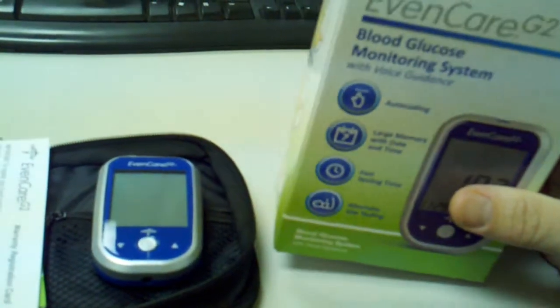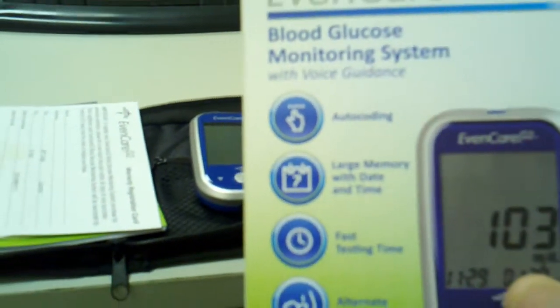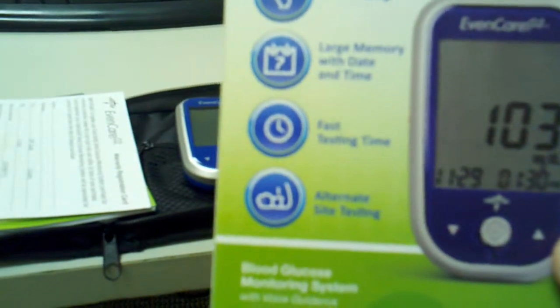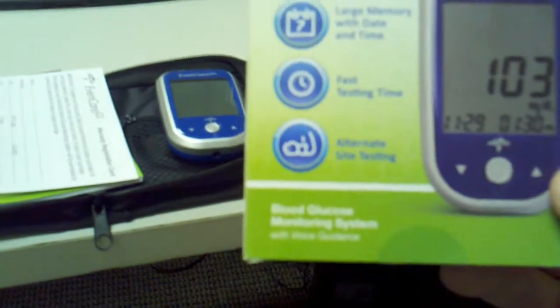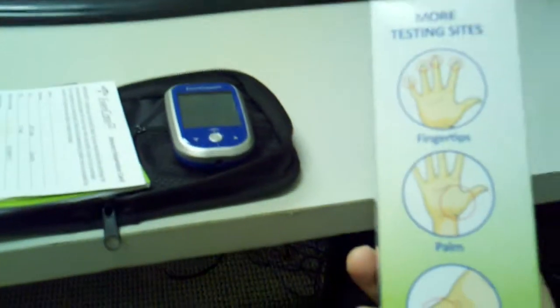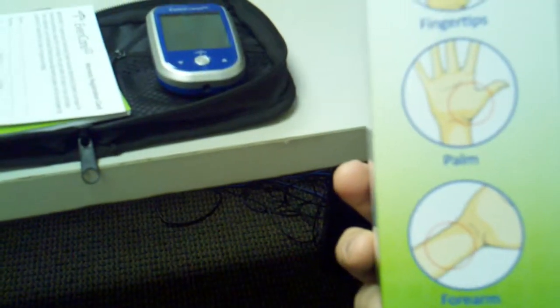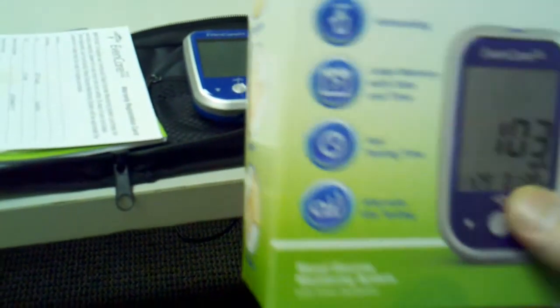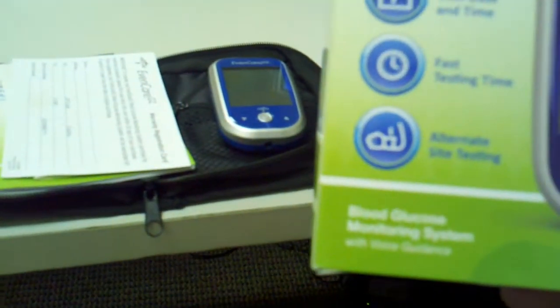Right now we are listing this on our website. This is the EvenCare G2 and this is the box it comes in. As you can see, it does auto coding, it's got large memory with date and time stamp, it'll save up to 300 memories, fast testing time, and — very critical, a lot of people call and ask us about — alternate site testing. It will test the fingertip, the palm, and the forearm.